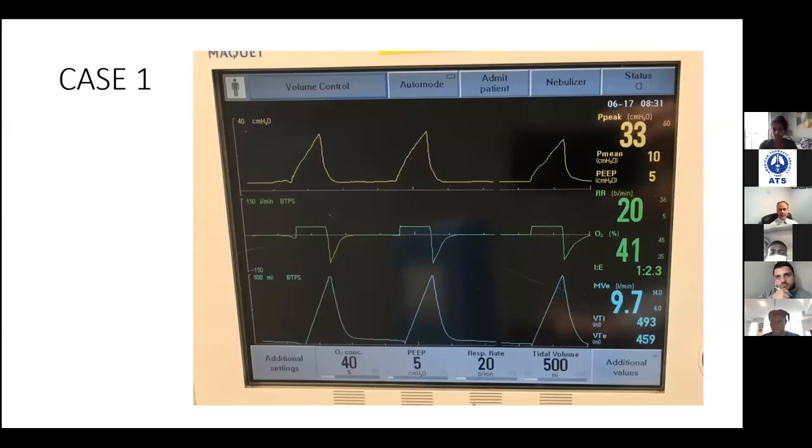Maybe one that you've never seen before, but do what I told you. And the first thing you're going to do is identify where the input is, okay? Where are the input values on the screen? Can you guys see them?